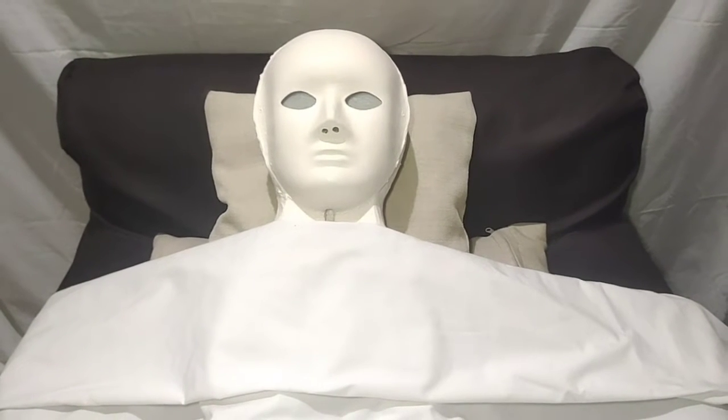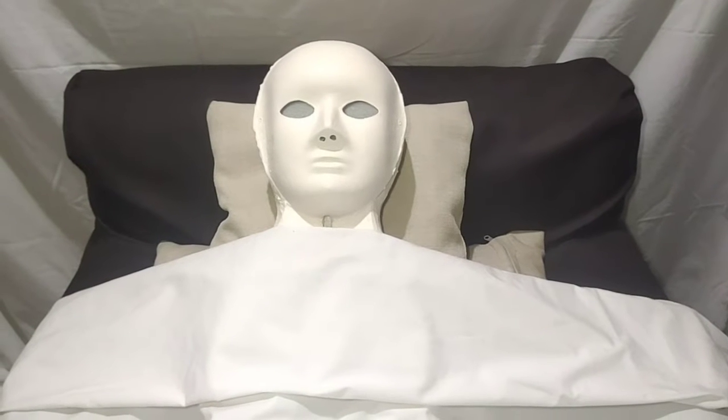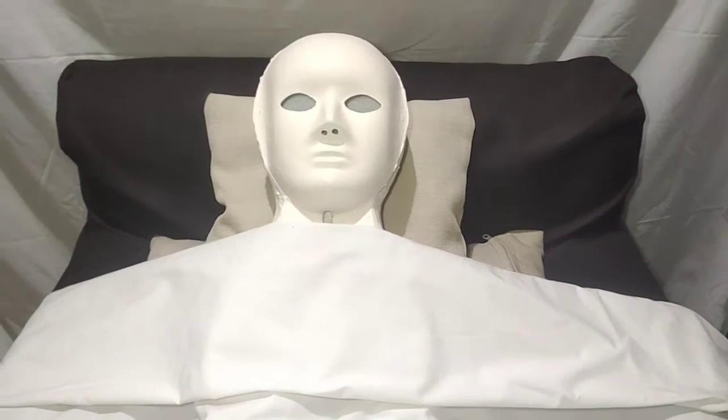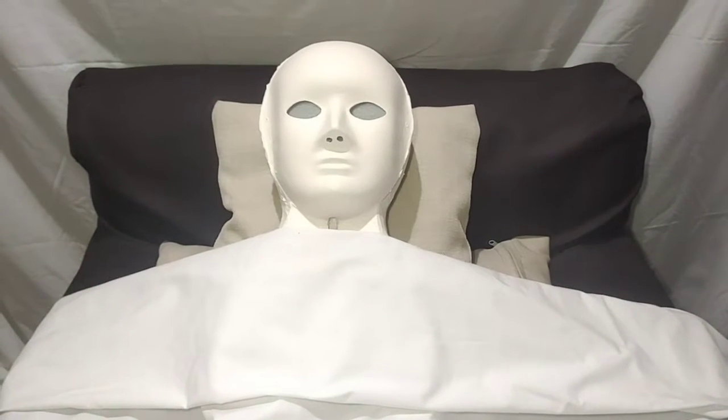After that is to identify the patient. This is to verify that we are handling the right patient. Hi ma'am, good afternoon. I am Lisa Nikdao, your attending nurse for today. And you are? What's your birthday?